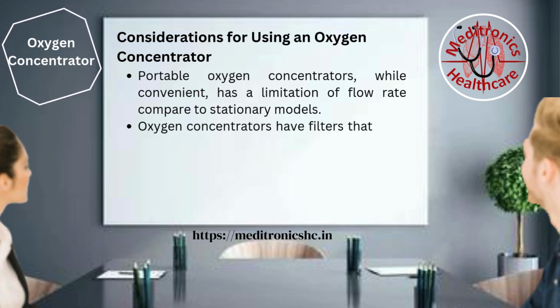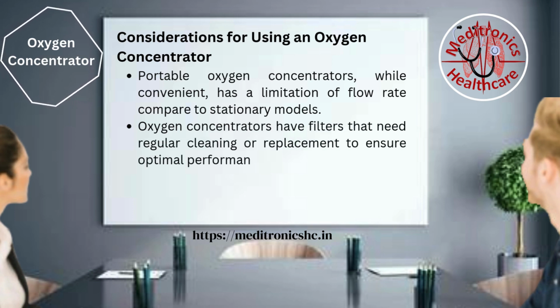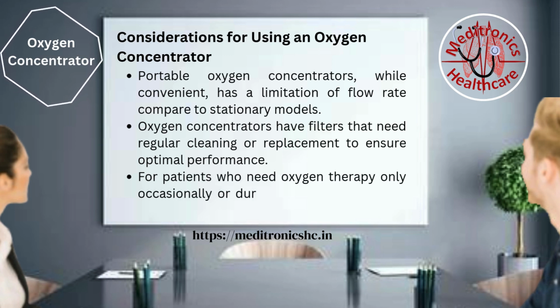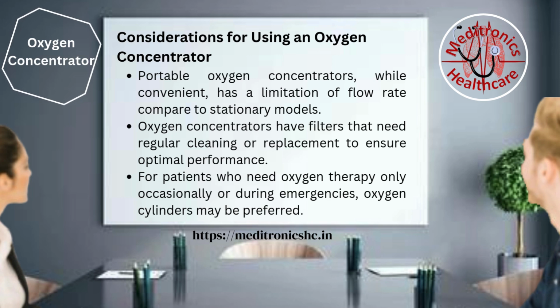Oxygen concentrators have filters that need regular cleaning or replacement to ensure optimal performance. For patients who need oxygen therapy only occasionally or during emergencies, oxygen cylinders may be preferred.